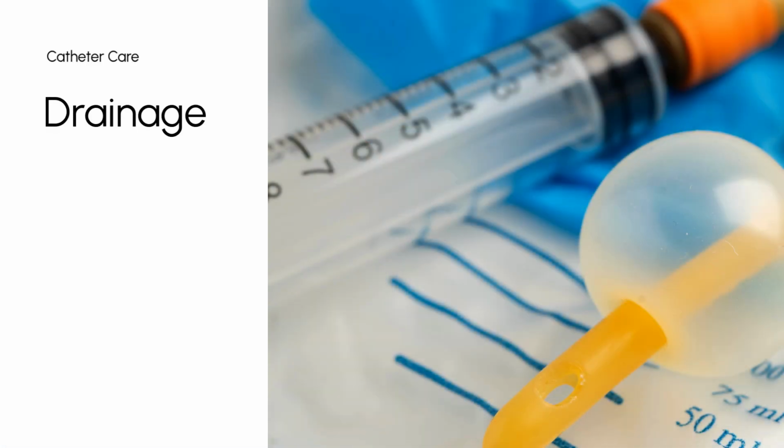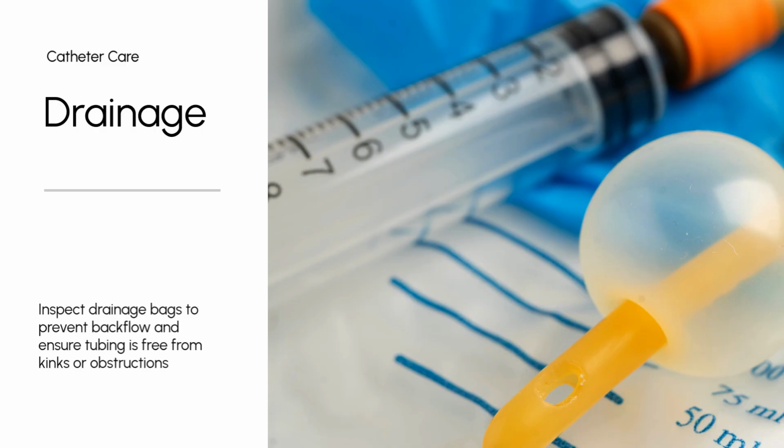Inspect drainage bags for proper positioning to prevent backflow. Ensure catheter tubing is free from kinks or obstructions. Verify the closed drainage system remains intact. Routine emptying of urine bags is essential. Proper perineal care and catheter site cleaning are crucial for hygiene.